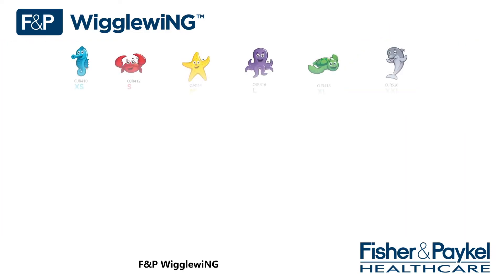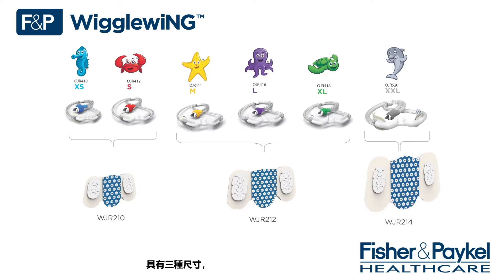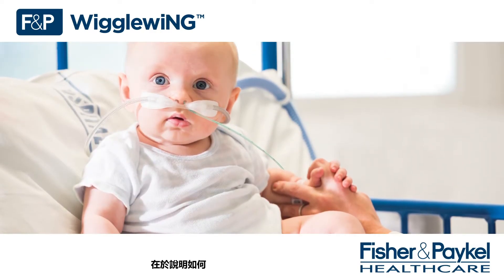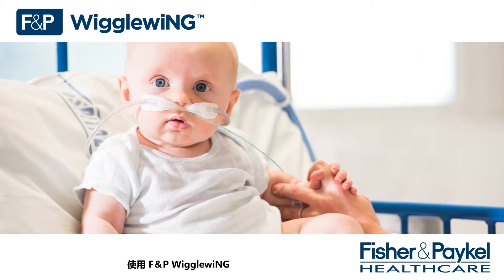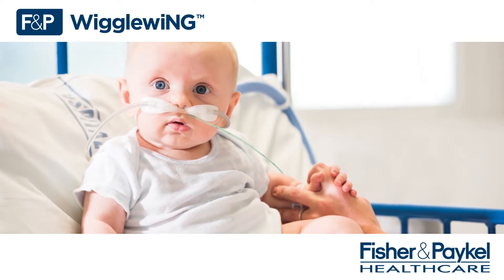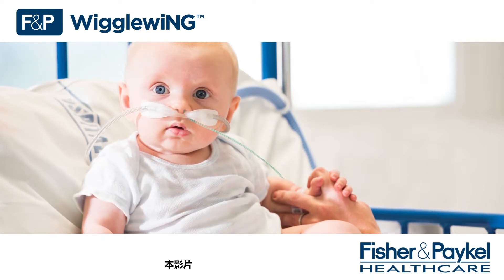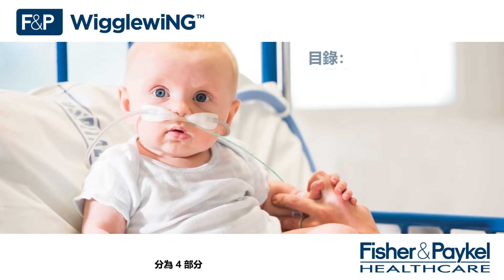The FMP Wiggle Wing is available in three sizes that are compatible with Optiflow Junior 2 or 2 Plus cannula range. The purpose of this in-service video is to explain how to correctly fit and use the FMP Wiggle Wing in conjunction with the Optiflow Junior 2 nasal cannula. This in-service video has been split into four parts.